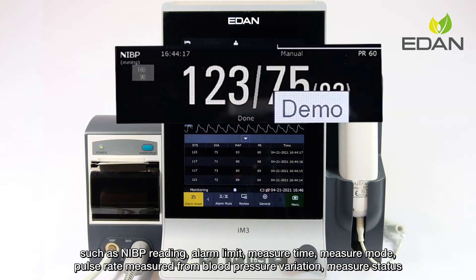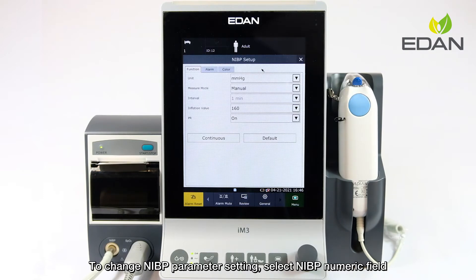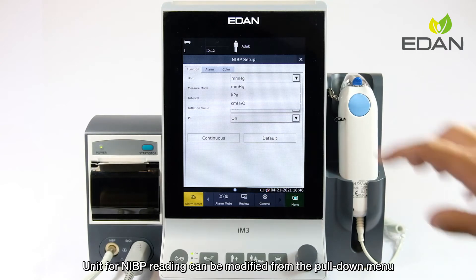The NIBP numeric field displays alarm limit, measure time, measure mode, pulse rate measured from blood pressure variation, and measure status. To change NIBP parameter settings, select the NIBP numeric field. The unit for NIBP reading can be modified from the pull-down menu.